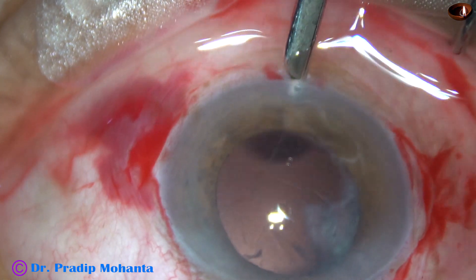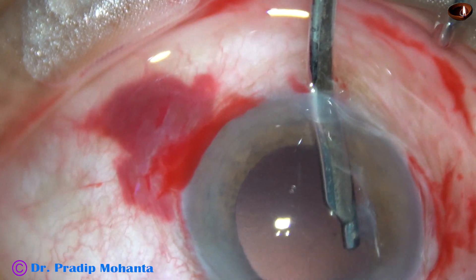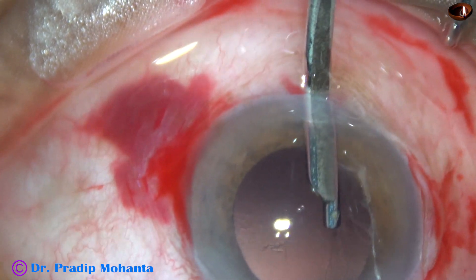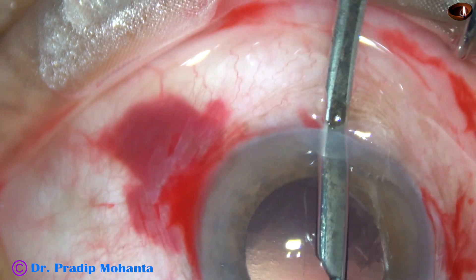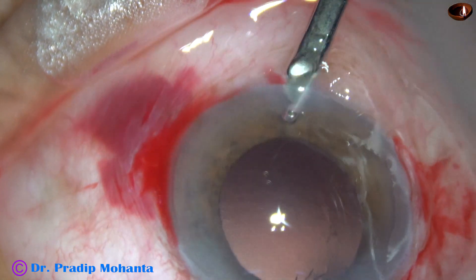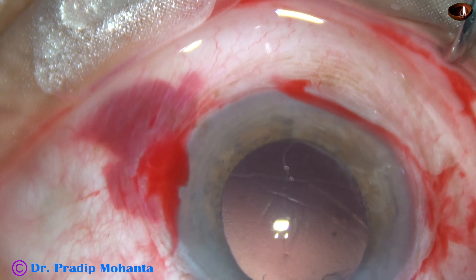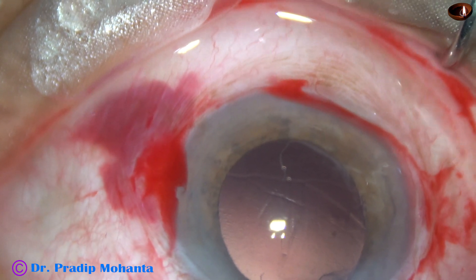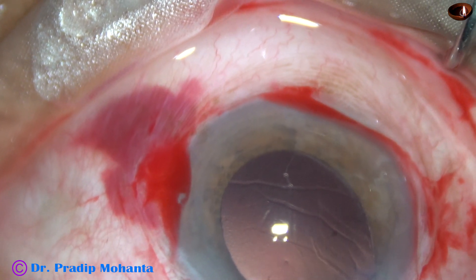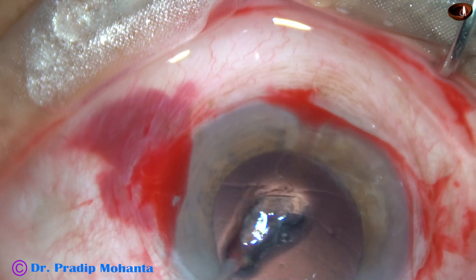And now I am aspirating the cortex gently with the help of this Simcoe cannula. And fortunately, the anterior vitreous face is still intact. There is no vitreous loss and there is no vitreous prolapse into the anterior chamber. And now after aspirating cortex, I am going to remove the capsular bag. Here it comes — the capsular bag has been removed with the help of these forceps.